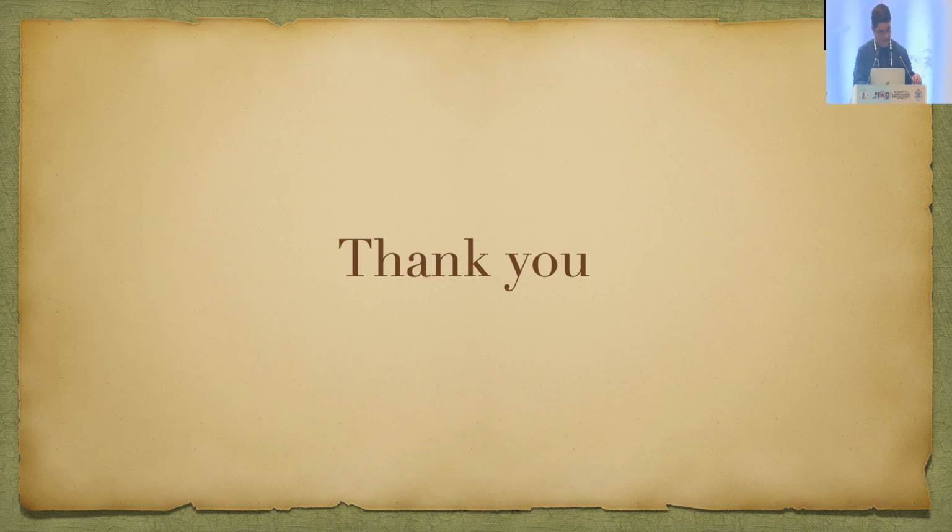Thank you very much. Thank you, Dr. Harshul, for presenting something which a large majority of people are doing. And yes, microkeratome is very useful. Only in very steep or flat corneas, there may be some risk. And the only minus point is that it is not under direct visualization as you can do in femtosecond. But otherwise, it does its work in a large majority, with SBK, with almost similar efficacy.